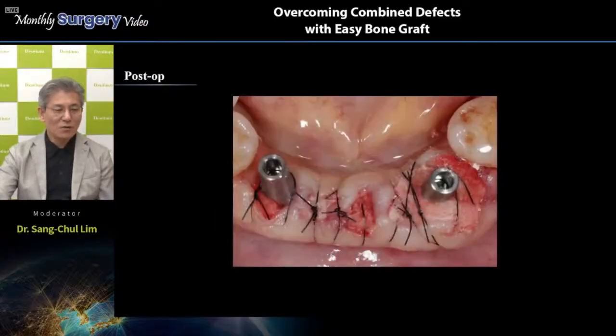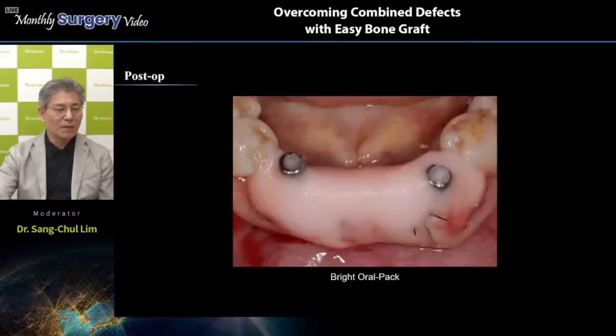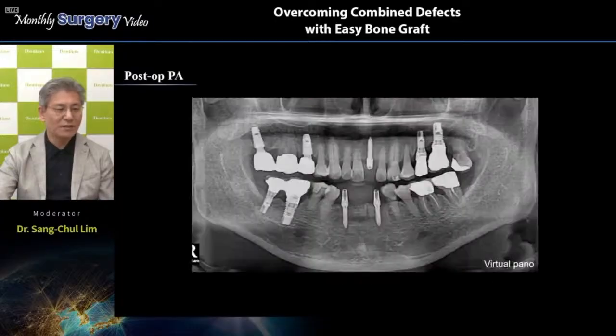This is the post-op intraoral view, with the implant fixture already inserted on number 42 and 33 area and covered with collagen graft. Underneath this material, bone graft was already inserted, and sutured. After the procedure finished, Bright oral pack was put on to cover and protect this surgery area.